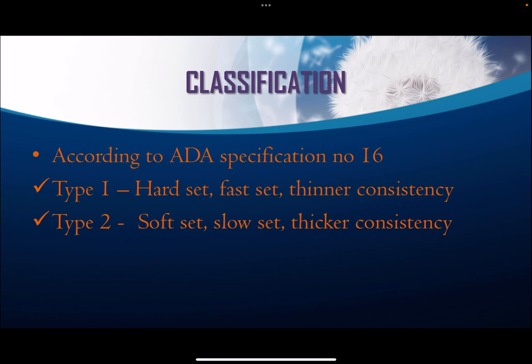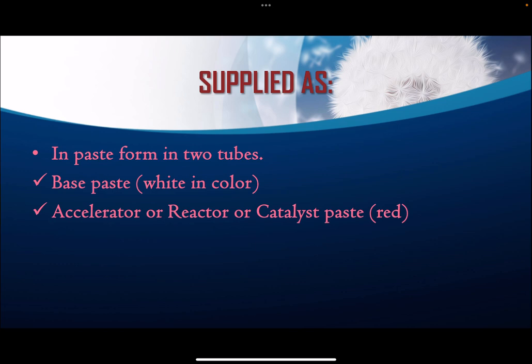It is classified according to ADA specification number 16 into type 1 and type 2. Type 1 is hard set, fast setting and of a thinner consistency, while type 2 is soft set, slow setting and of a thicker consistency.